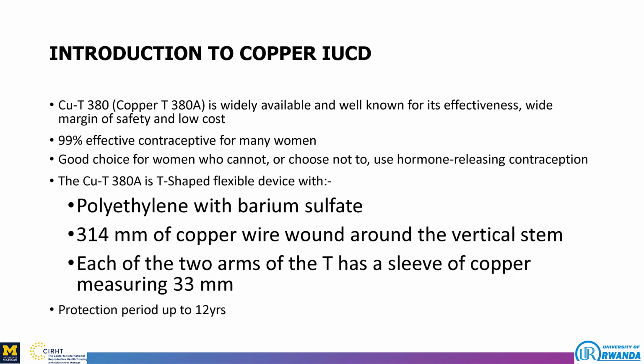By introduction, the copper IUD contains copper T380A, is widely available and well known for its effectiveness, wide margin of safety and low cost. It also has 99% effective contraceptive for many women globally. Good choice for women who cannot or chose not to use hormone-releasing contraception.